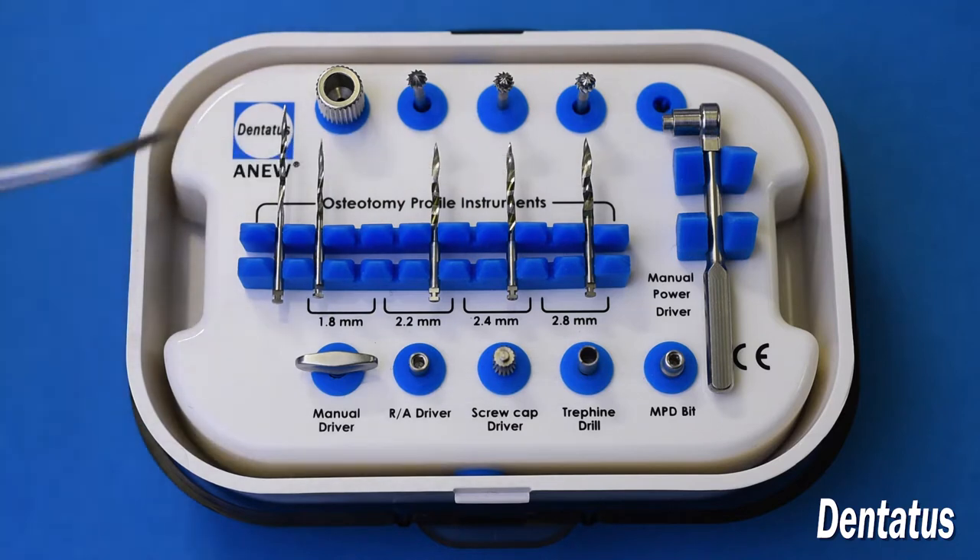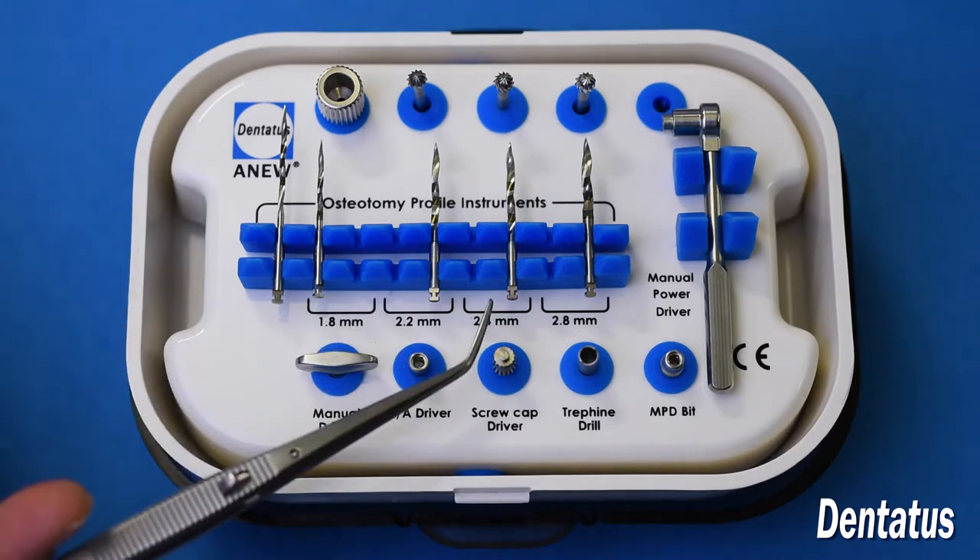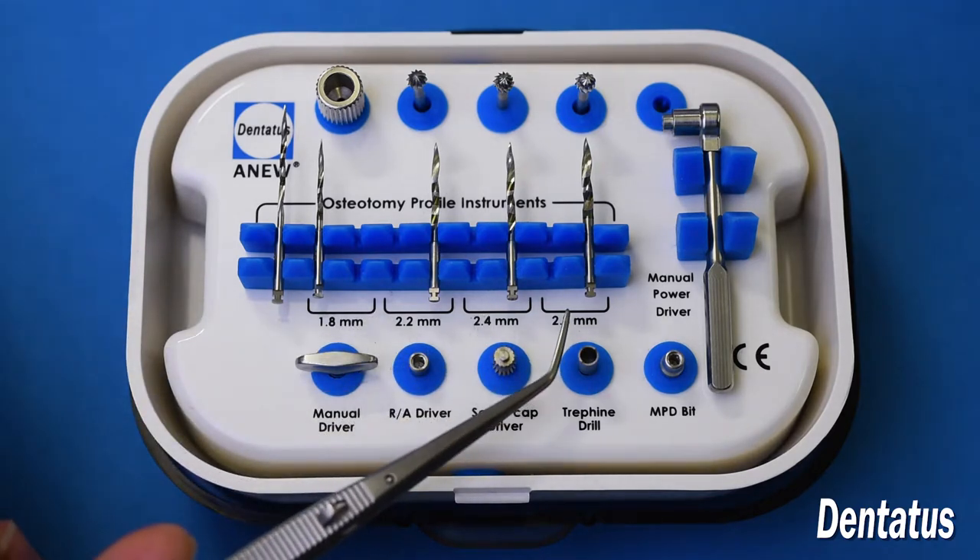Here you have your SIPO drills. They're laser marked to correspond to the implant sizes in 1.8, 2.2, 2.4, and 2.8 mm diameters.